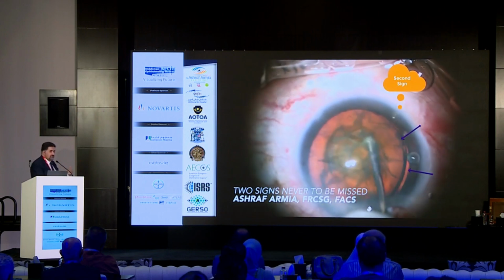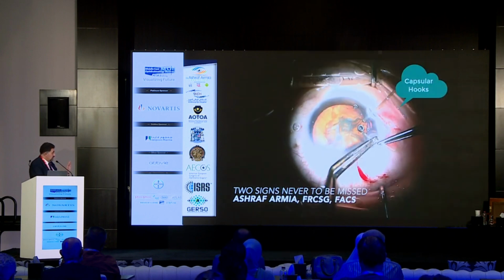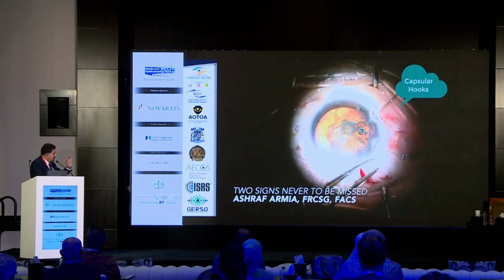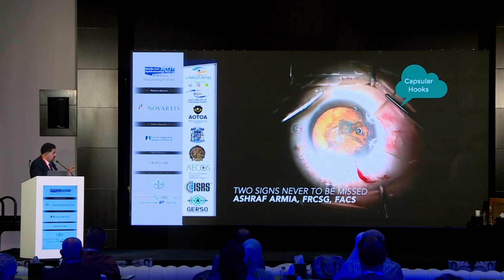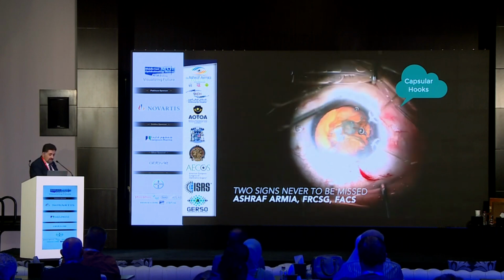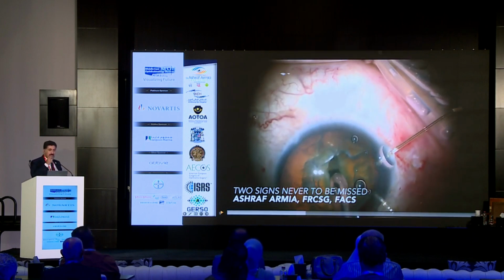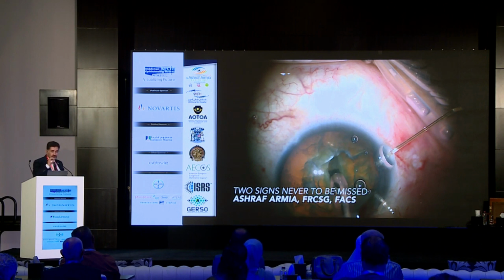Don't say I can manage. This is a very big mistake. So stop, put your capsular retractors at the sites of subluxation. Why? Because these capsular retractors will make new zonules for you and very good zonules. You are going to see how we are going to continue the case, and at the end you are going to find the rhexis is still central.